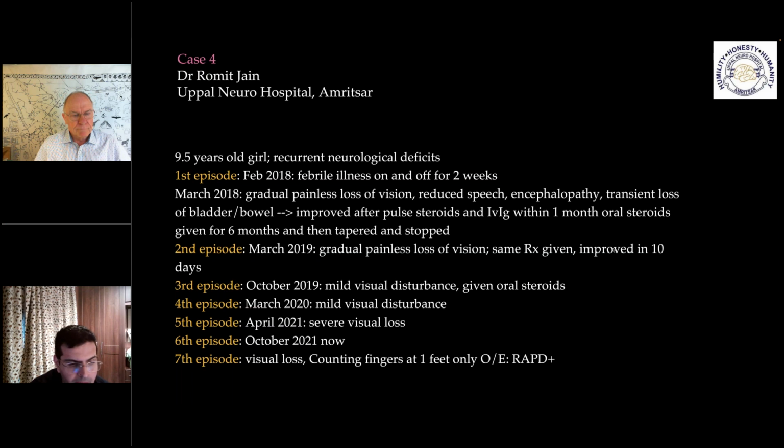We can move to the MRI. Okay. So the MR is after the 7th episode. A question to the history, if I may: was the loss of vision bilateral or unilateral? Bilateral loss of vision. Okay. The MR is a recent one? Yes, sir. I sent you multiple MRIs. The pictures are of the older MRIs, and the full CD that I sent you was the recent MRIs. So essentially you're giving optic neuritis here in the story? Right, sir. Yes.